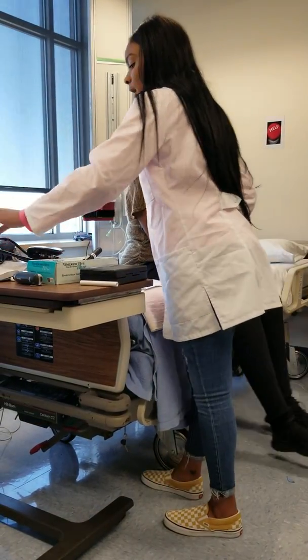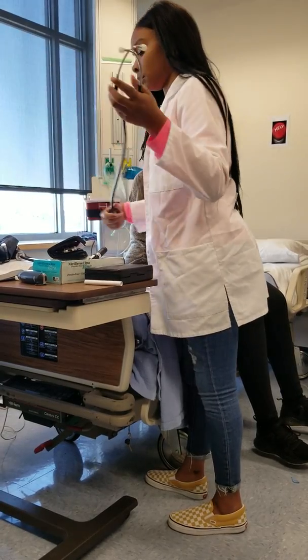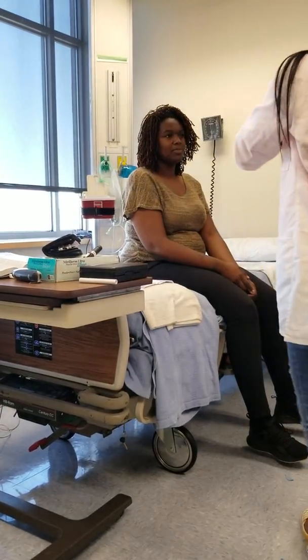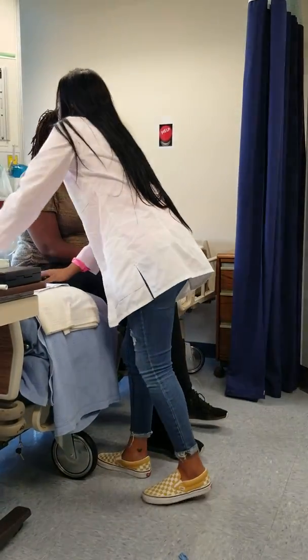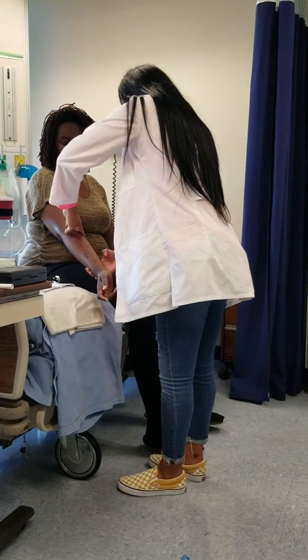Why don't you look at that? Next, I'm going to take your blood pressure. I'm going to locate her brachial pulse.